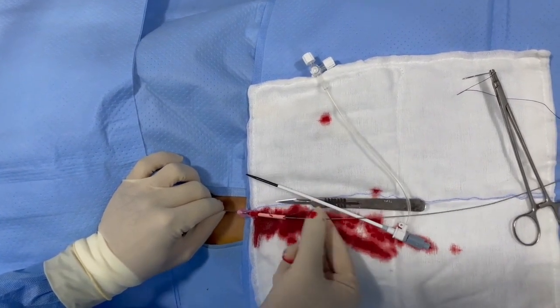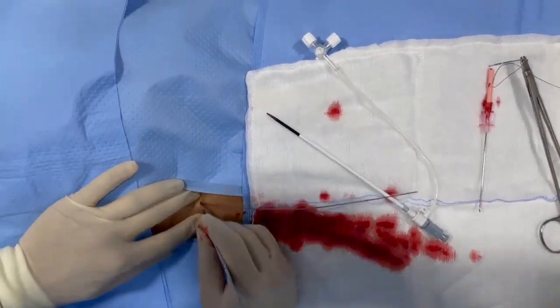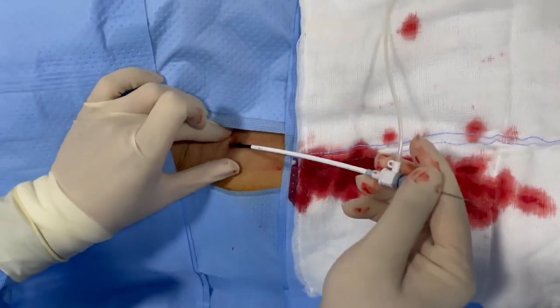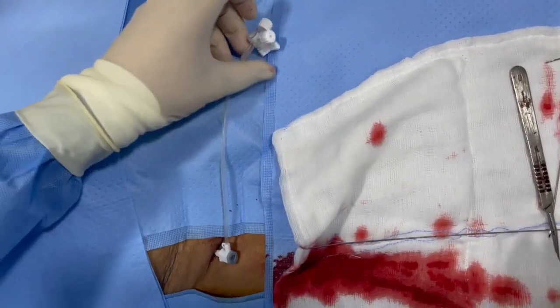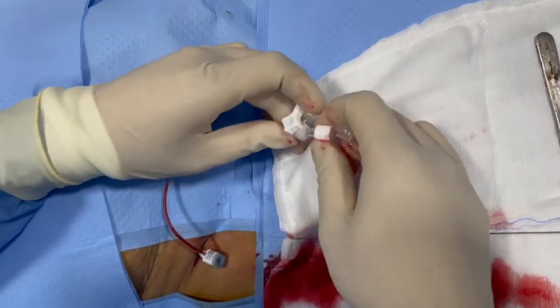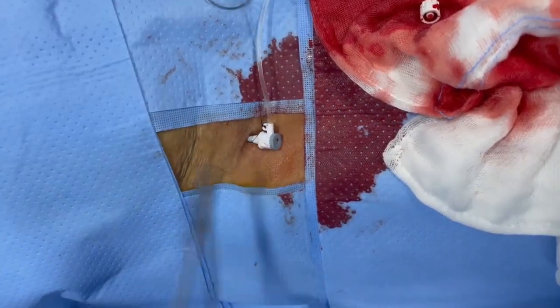Once there is free pulsatile blood flow, we stop advancing the needle and insert a J wire through the needle. Once it is inside the artery without any resistance, we remove the needle, make a stab incision over the insertion site, and insert the femoral sheath with dilator. When the full length of the sheath is inside the artery, remove the wire and dilator simultaneously and allow blood to come out through the side arm of the sheath. Then we connect it with the flush system and secure it with silk 2-0 cutting suture to the skin.